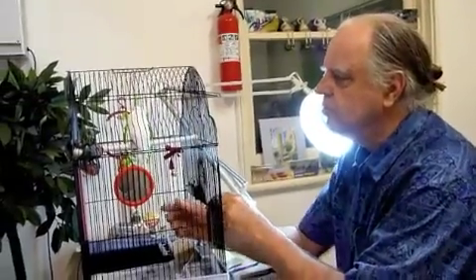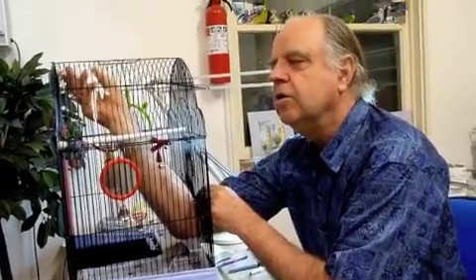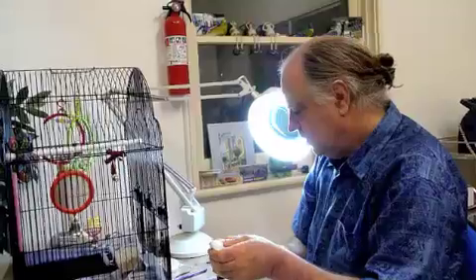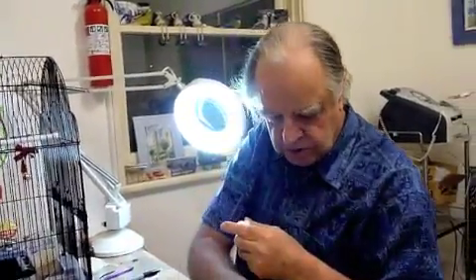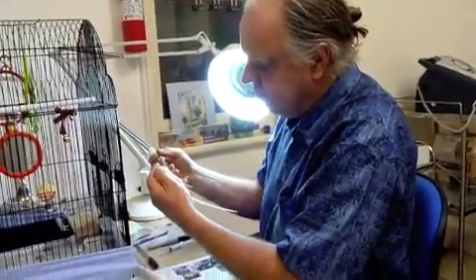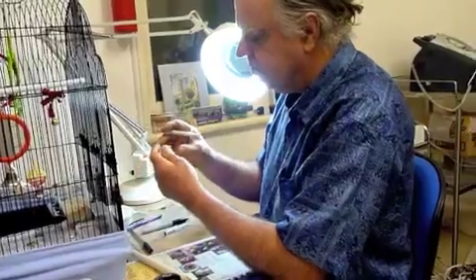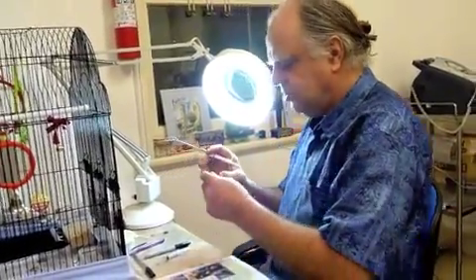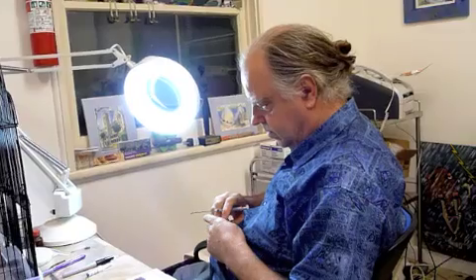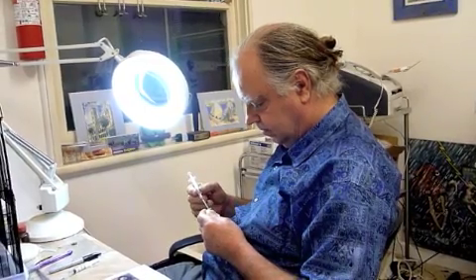Casper, we have to do a crop wash. I'm sorry — I don't like having to do this, but we just have to. What we're going to do is pass the tube down his throat over his tongue down to this part of his throat. We'll get a little sample out unless he shows distress — if he shows too much distress, I'll use my judgment and stop. It's not a procedure I like doing, but it gives us a diagnostic sample in most cases.